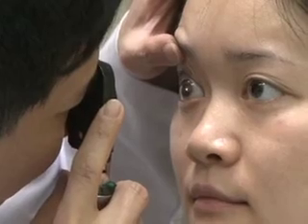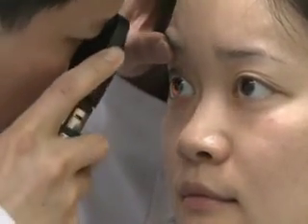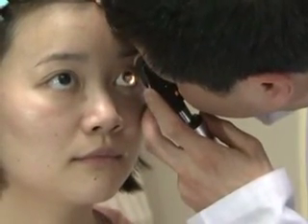Direct ophthalmoscopy is an important screening tool that can be mastered with practice. It may be performed in minutes during the general medical examination and poses virtually no risks to the patient.